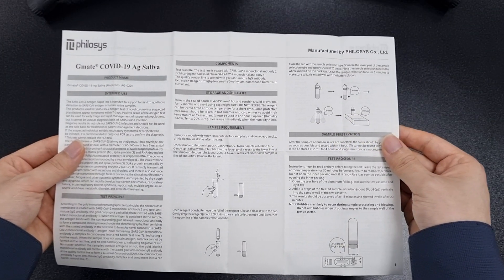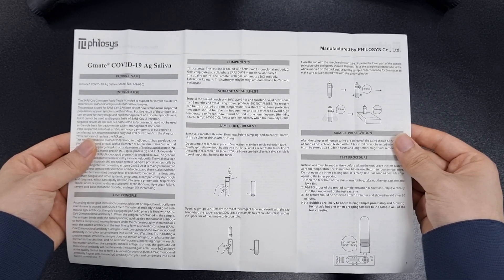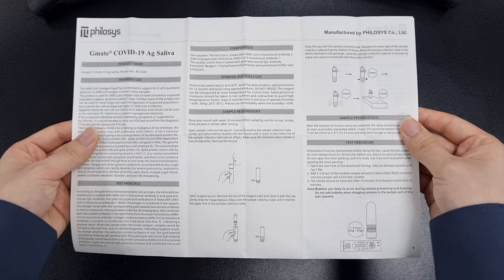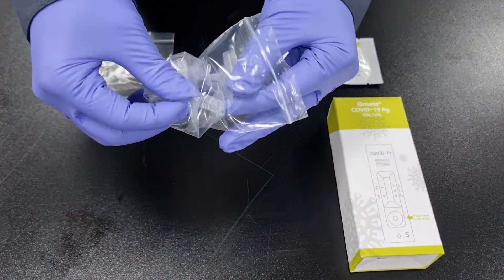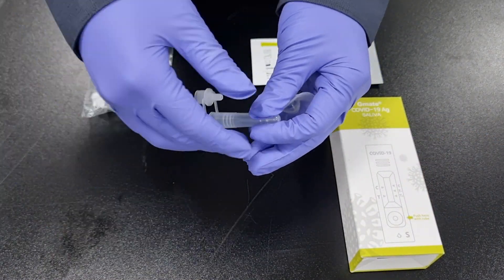Step 3: Carefully read the instructions for use before the test. Step 4: Take out the sample collection tube and funnel from the zipper bag and combine them.